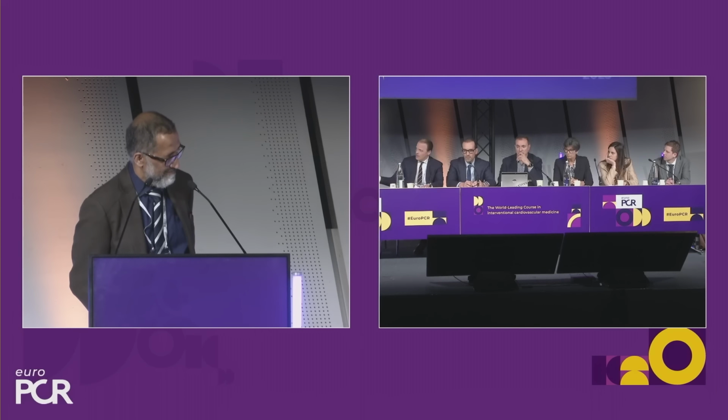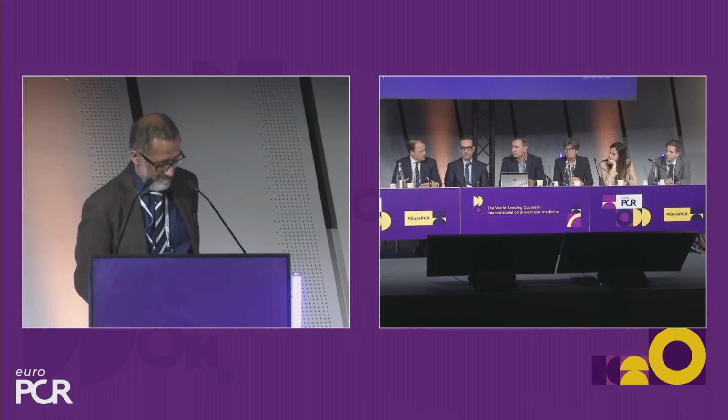So I find myself asking less and less for coronary angiograms, especially in patients that are at low risk for coronary disease. Of course, imagine mitral patients who would undergo endoscopic mitral valve repairs. We stop doing angios altogether because they receive CTs anyhow for access planning, ruling out calcium on the mitral annulus and these things. If there's no coronary calcium, we don't proceed. If there is risk, like you say, youngish aortic stenosis patients with some risk profile, we are still conservative and would ask our colleagues for an angio. Okay, thank you, very clear. So let's now discover how you treated your patient.